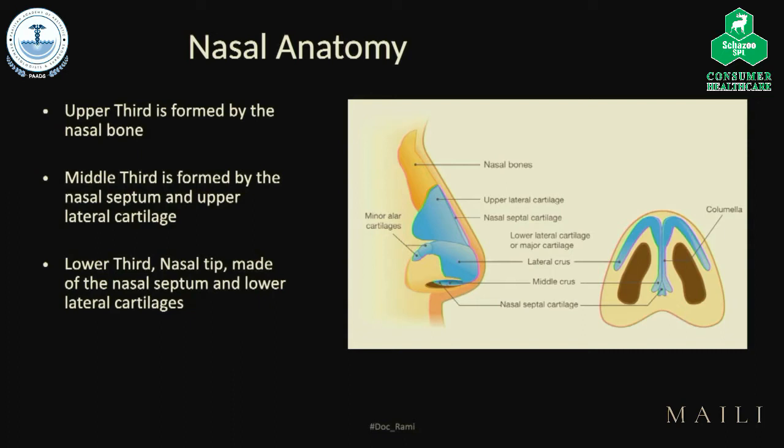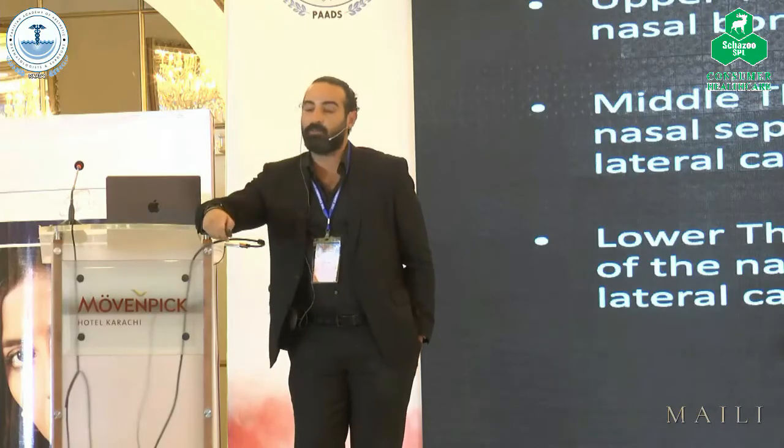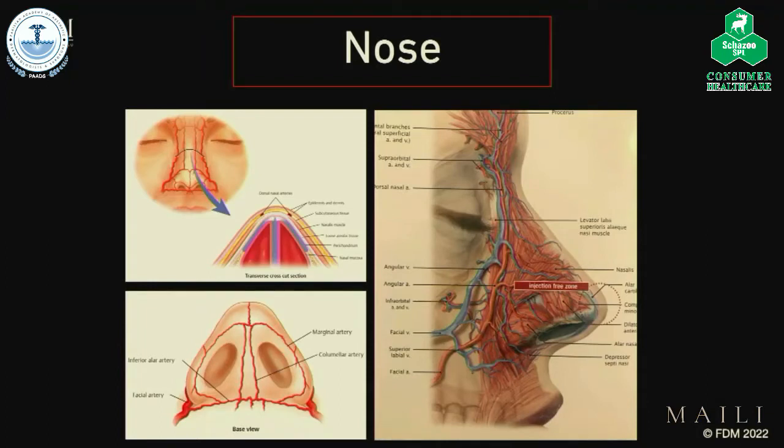Usually, we place little drops along the bridge of the nose, not the lateral side, because that's where the arteries and the vessels are. Remember, it is very vascular, and it is very technique sensitive. So we're going to show you now.